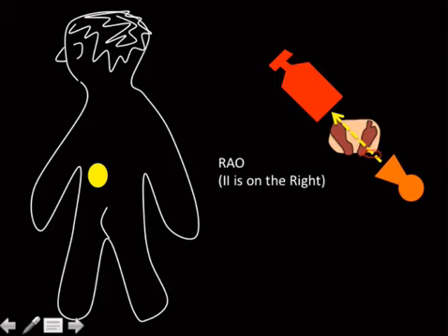So just as a general idea, below 2 gray, you're probably going to be okay. Between 2 and 5 gray, you may very well have burned your patient, and you have to look out for that, especially around 10 days post-procedure. And if you happen to give somebody more than 5 gray, well, then you're going to end up getting reviewed by the physics department. All right, so that's the end of this talk.